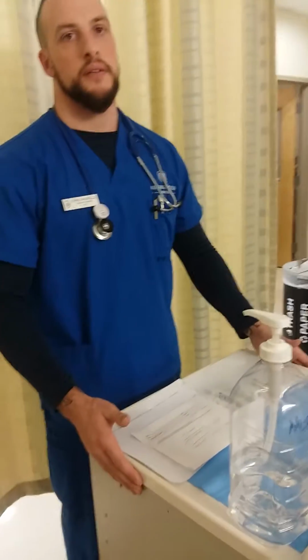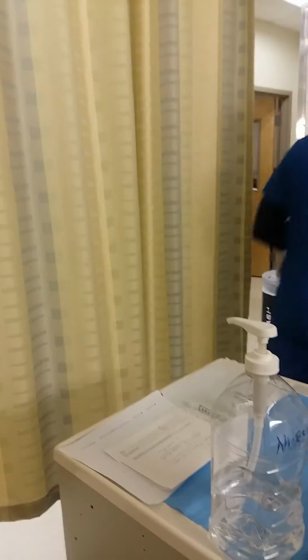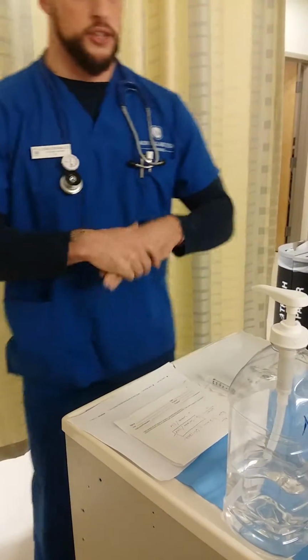So that's our rate. Second thing I would do is take my medication cart and bring it outside the patient's room, and then perform hand hygiene. Once outside the patient's room, I would unlock the medication cart using the correct code. This is also the time where I'd look at the medication administration record, and I'd also look at the medication itself.